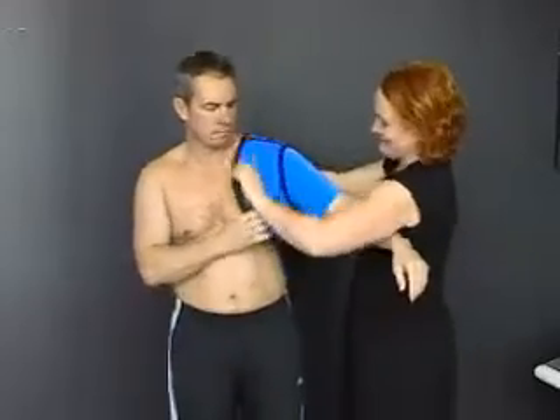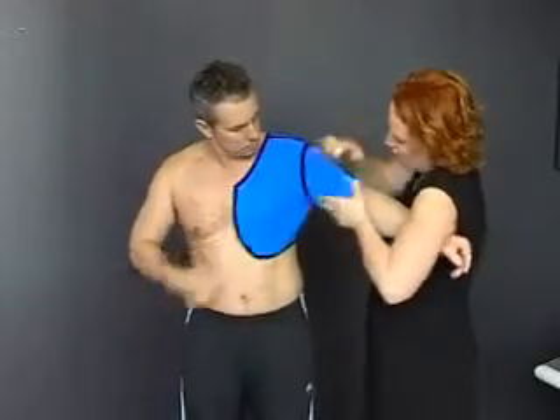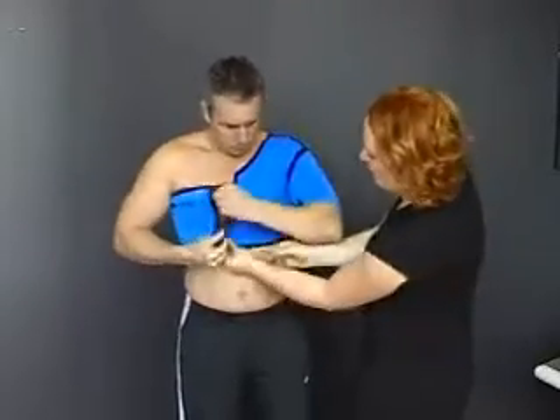Slide the brace onto the arm and attach under the arm. Wrap the brace around the body and firmly fix in front.